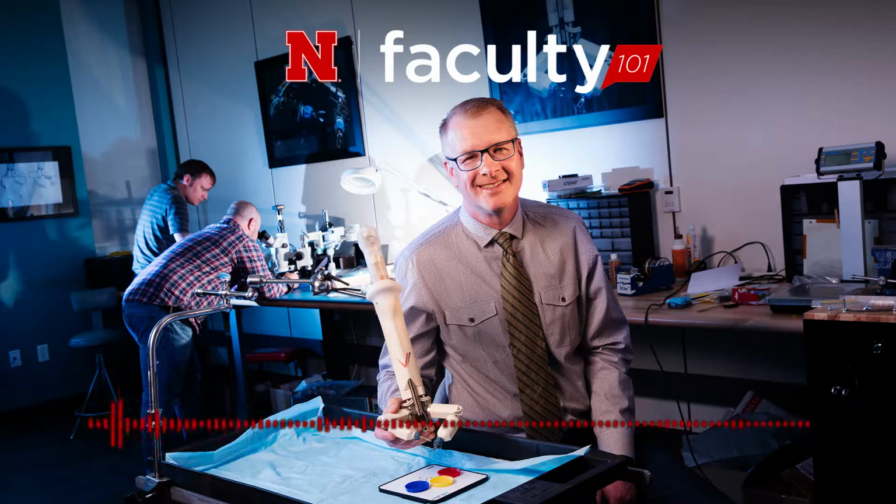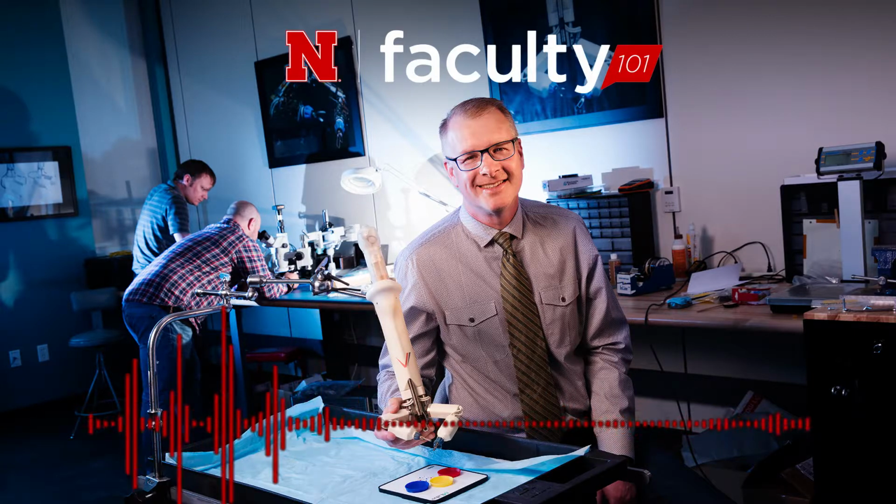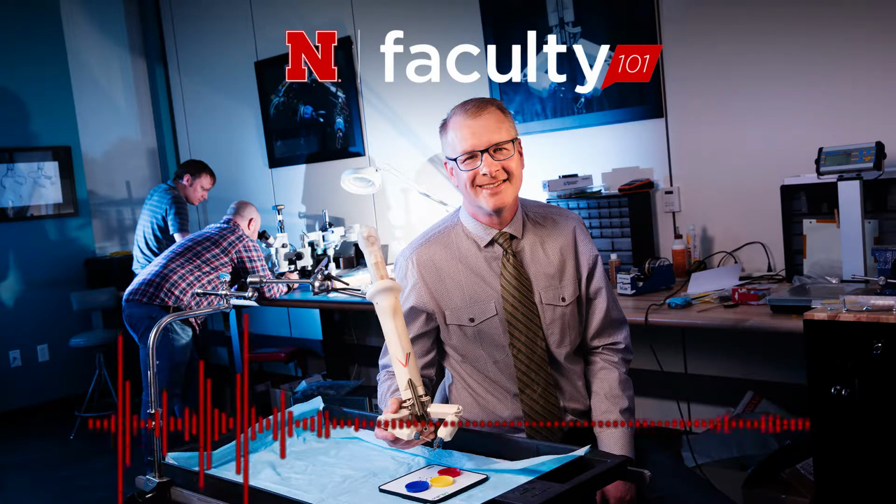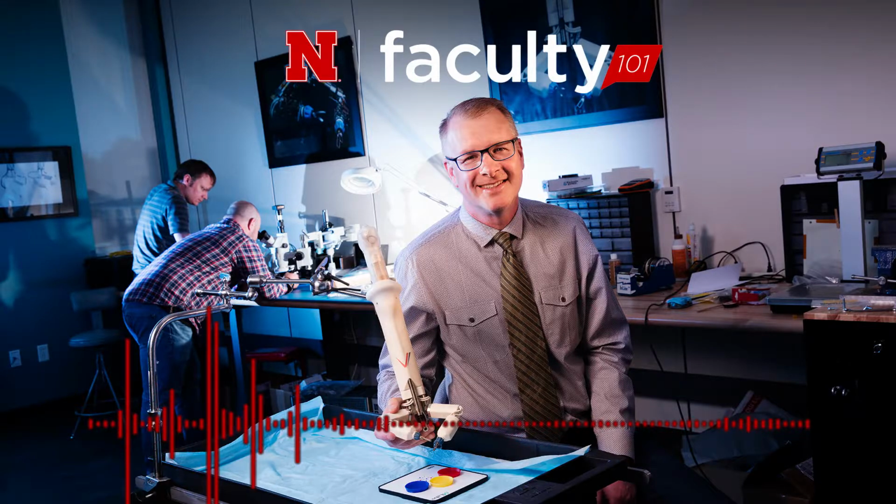You can scale the motion of the surgeon. If the surgeon moves their hands a lot, the robot can be very precise and move a little bit. They can remove tremor and some other things like that. But it's about access. They can give the surgeon more dexterity than they would otherwise have. And one of the big advantages is allowing minimally invasive surgery. So rather than making a large incision big enough the surgeon can get their hands inside the patient, you can make a few small incisions and stick some little robot hands in there and do surgery that way. And making smaller incisions has obvious advantages to the patient.